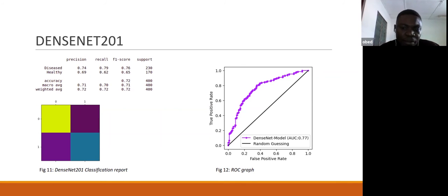if we're looking at deploying the model for a screening purpose. So in a large population, we are interested in, let's say, catching all the people that are actually positive in the population. So if it's a COVID-19 situation, you will quickly want to identify people who have the disease and quickly take them out of the population and isolate them. So the model should be able to at least get all the positives, right? And that is giving me a 0.79, right? Not so bad, moderate performance.